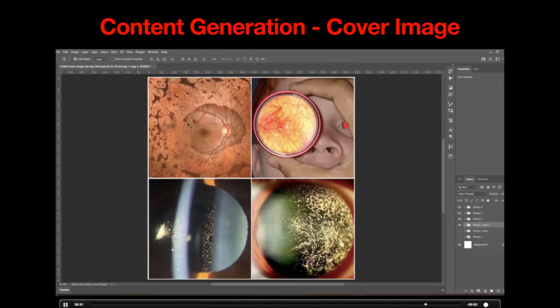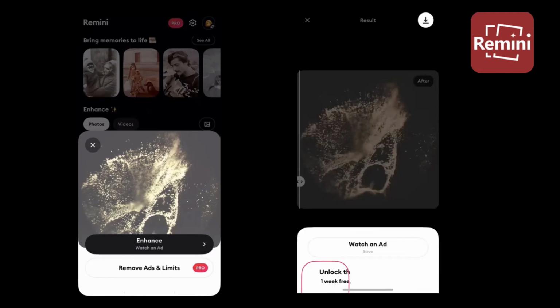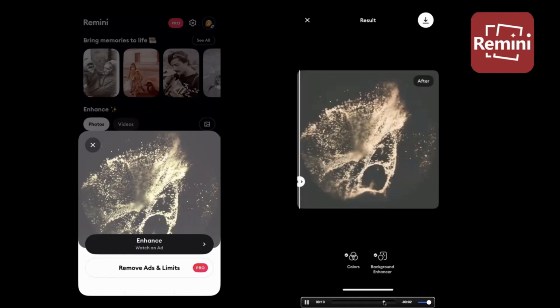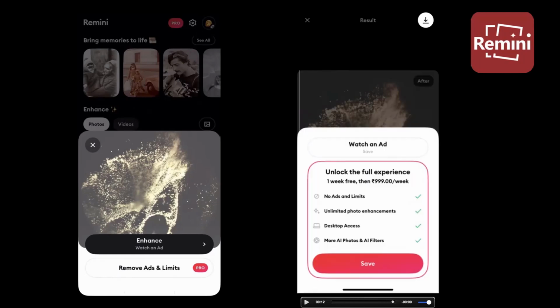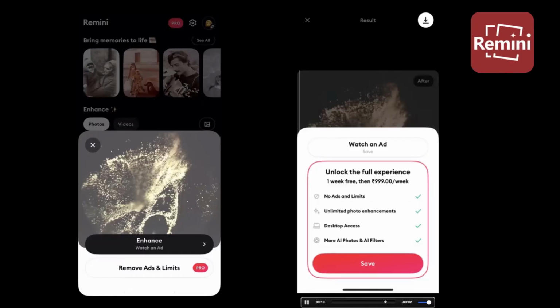So this is again in Remini, one of the prompts that I wanted to show you in Remini, a synthesis scenario where you take a good fundus image and you can see the small enhancements that you do, even if it is going to be for your collection. This is before and after again, which I wanted to show you. So these applications are now coming in, and there is a fine line between enhancing and tampering. I don't advocate tampering, but these are some small enhancements which give you a lot of visual credibility, and also you can have it with you in your own virtual museum in your laptop.